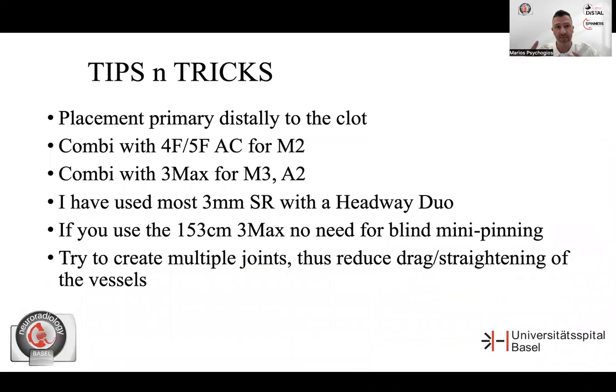So again, if I can summarize, our tips and tricks for distal occlusions: we still try to place the stent retriever distal to the clot. So it's the same as we did for the LVOs with our SAFE technique. And actually, I describe it to our fellows as the SAFE to SOLUMBRA technique, because you retrieve the whole system to a large aspiration catheter. So you can think of it as a combined SAFE to SOLUMBRA.